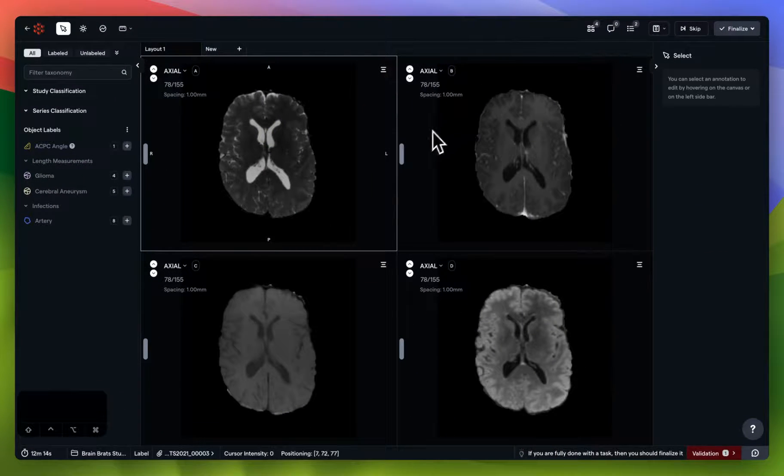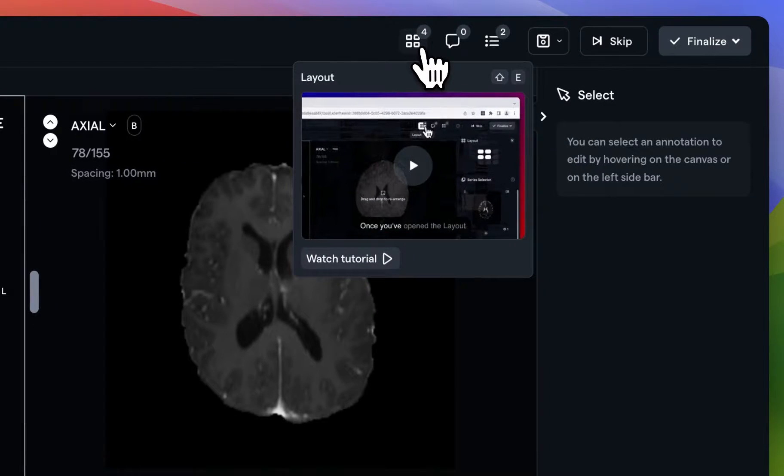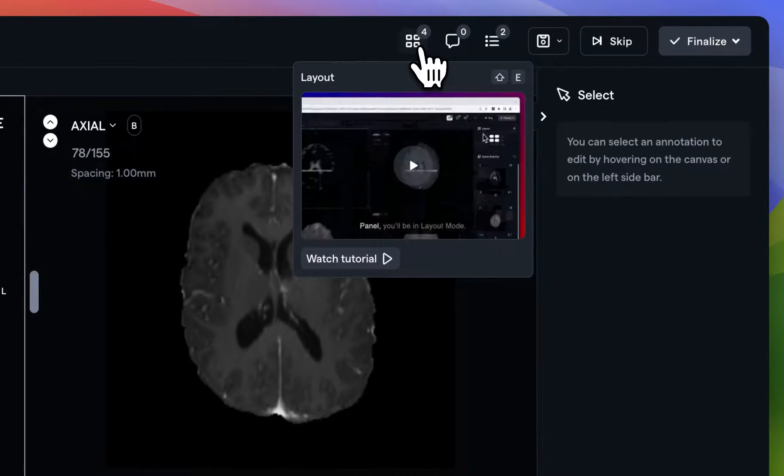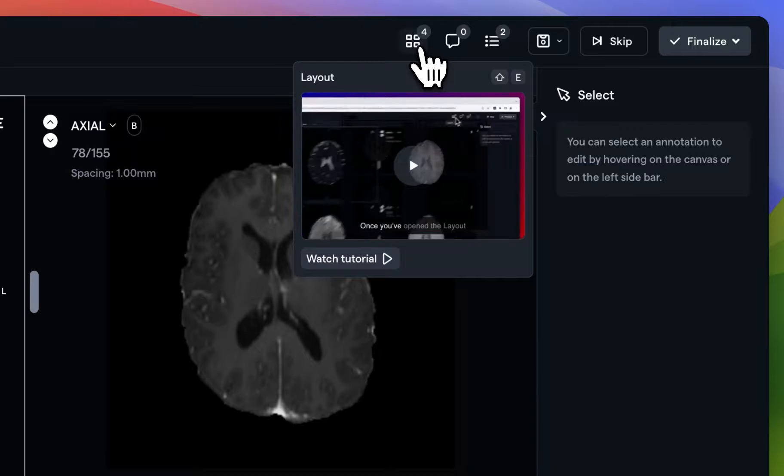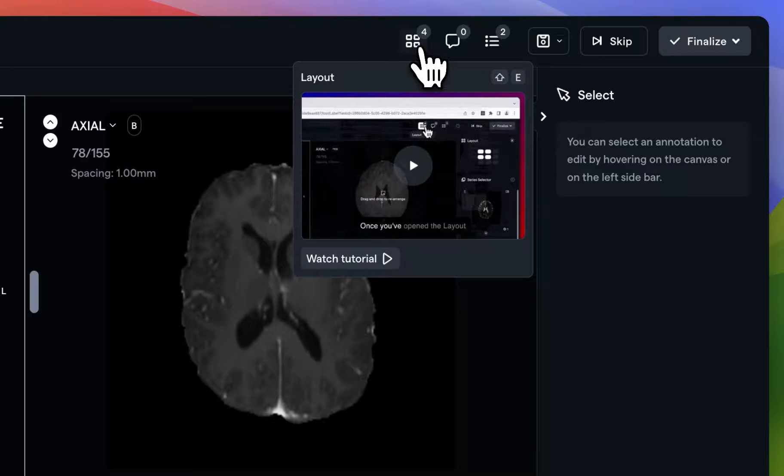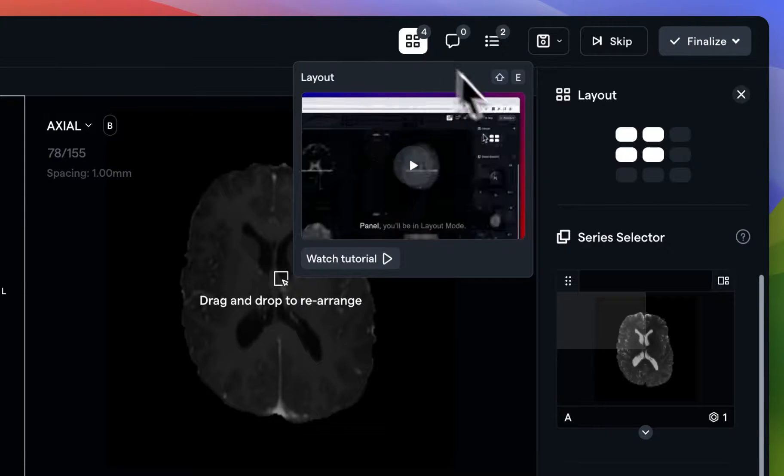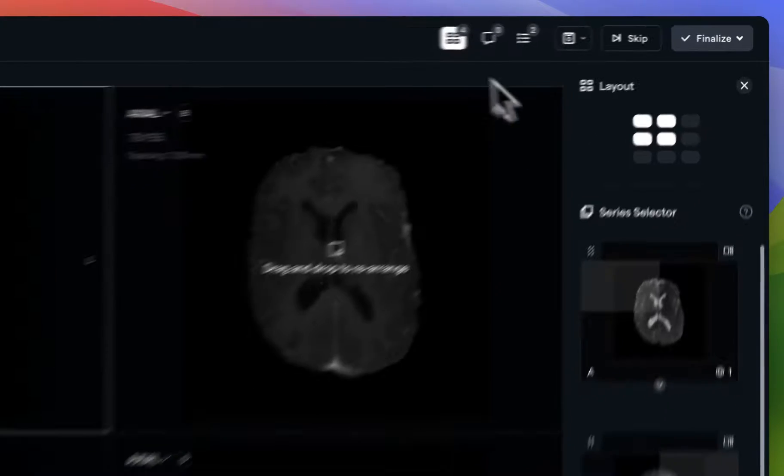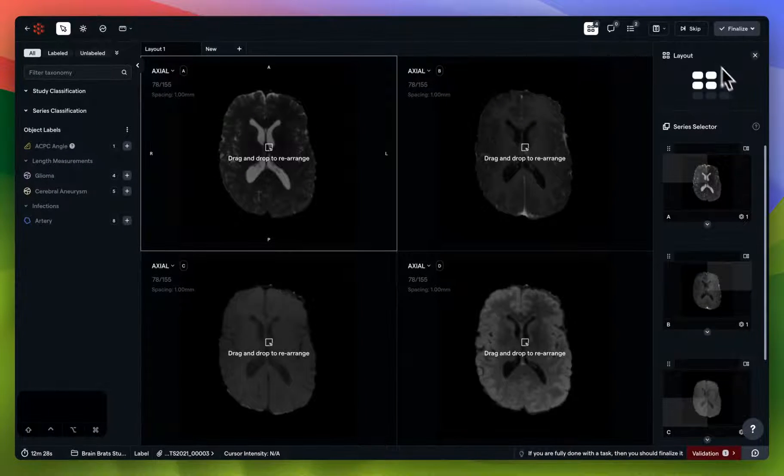Next up in our environment settings is the layout button. As you can see, our layout button shows that we have four individual series, making this a multi-series study. Click on the layout button to expand the layout tab.